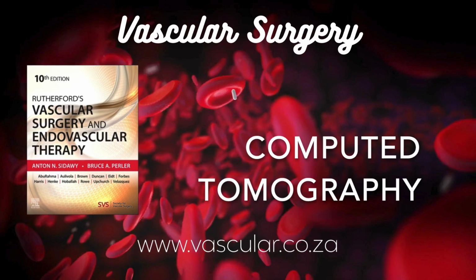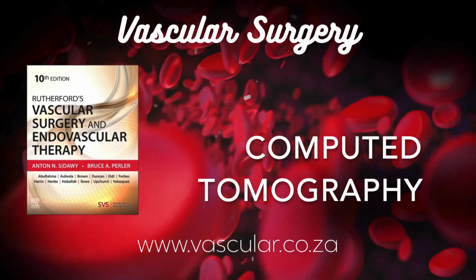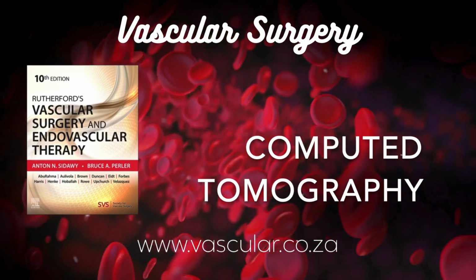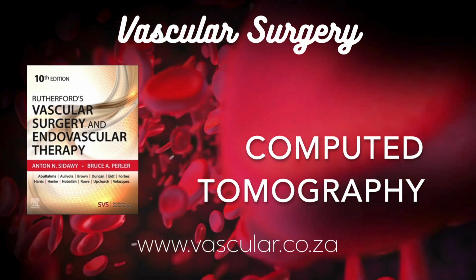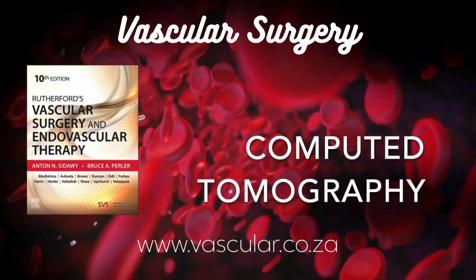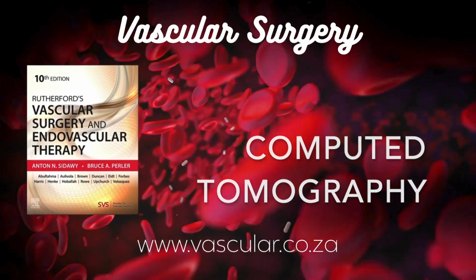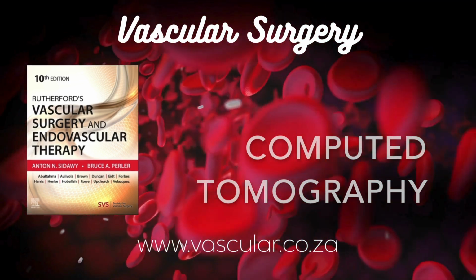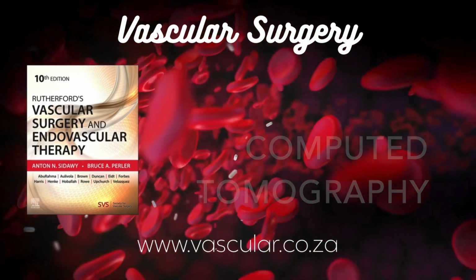Okay. How are these 3D views typically displayed? You mentioned SSD. Shaded surface display, SSD, is very common. It creates what looks like a solid, opaque surface of the structure. The software adds shading based on virtual lighting to give it a sense of depth and shape. Good for overall anatomy. Yeah, great for getting a quick grasp of complex spatial relationships, like how vessels branch, but because it's just the surface, you don't see inside the vessel or get fine detail.